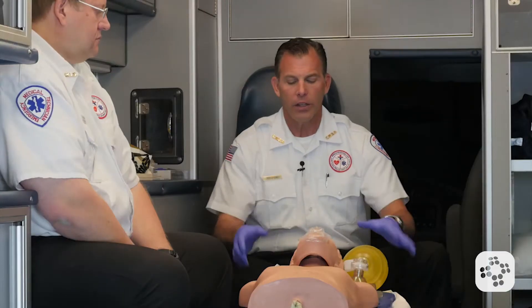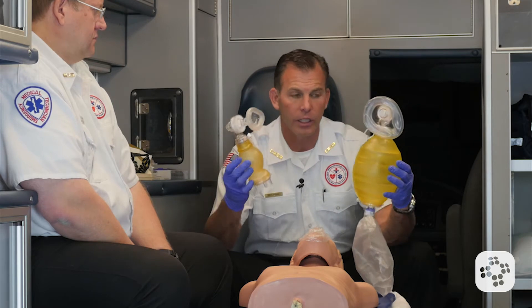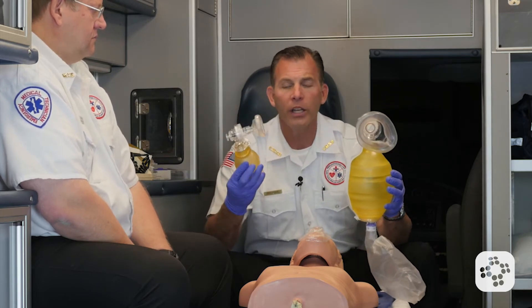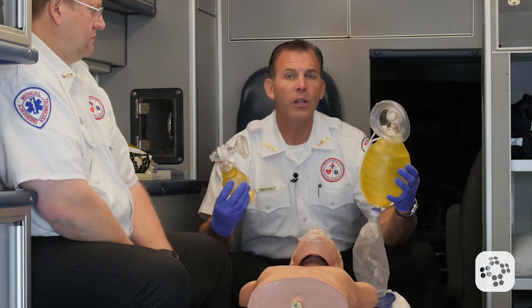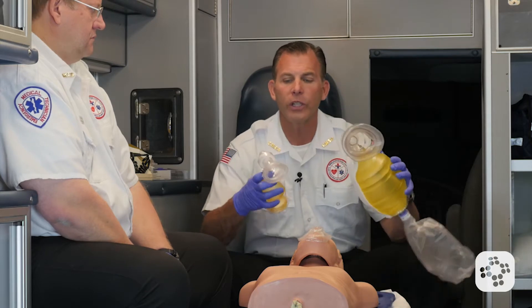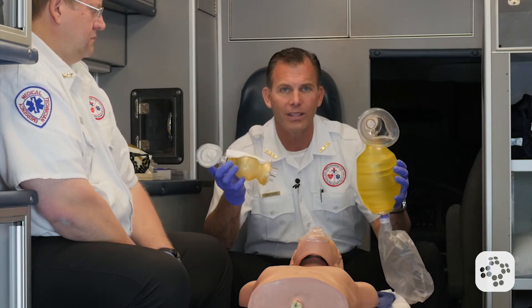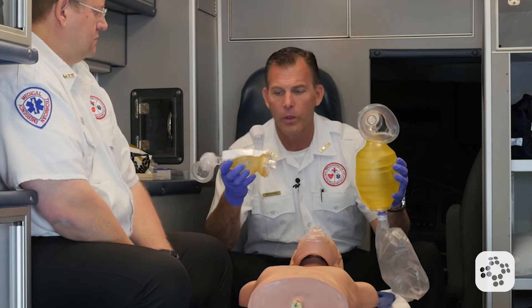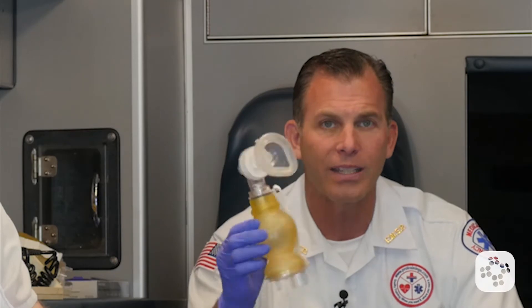There are a couple of different sizes we should make note of. As you can see, there's clearly a difference between these two bag valve masks. One is for an infant, the other is for child and adult. They deliver different amounts of air into the lungs and have a different size mask that corresponds with the size of the bag itself. Ideally, you get the right size tool for the right size job.